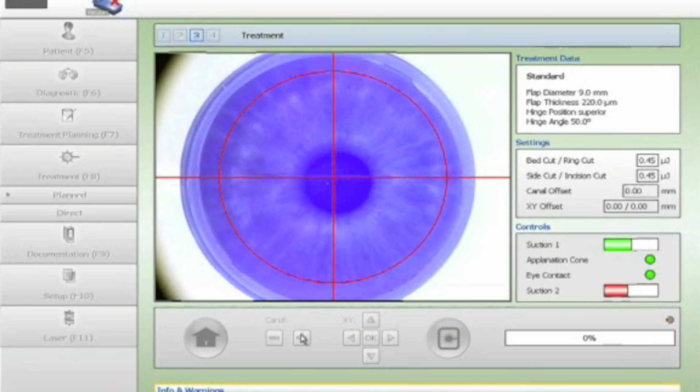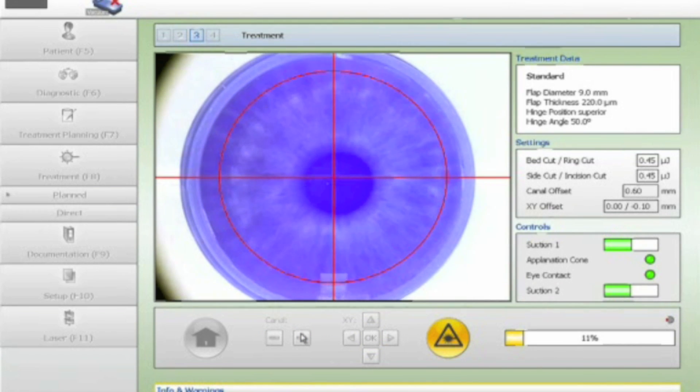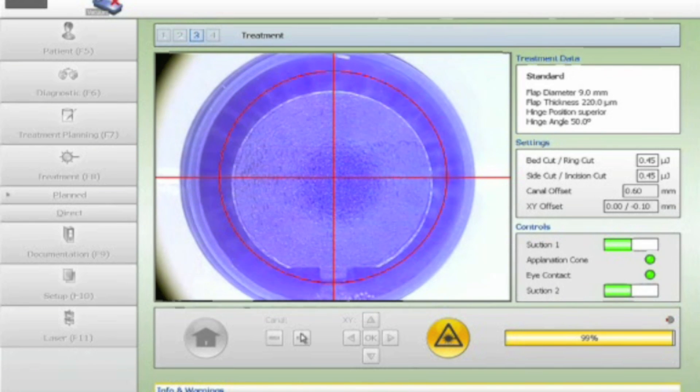Once the bar is green, the digital flap overlay appears and can now be manipulated using the keyboard or controls. The femtosecond commences first with the tunnel, and because the spot-line separation is finer at a higher resolution, the progress is much slower at a depth of 200 microns. For a routine LASIK flap at 100 or 120 microns, the time taken to create the flap is typically 6 to 7 seconds, but here at 200 microns it takes about 3 times longer. Once the flap is completed, the suction automatically disengages.